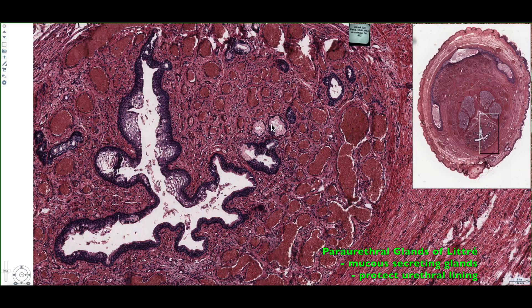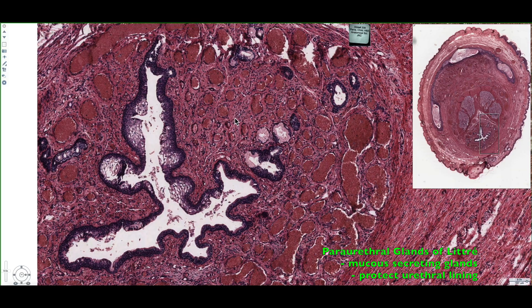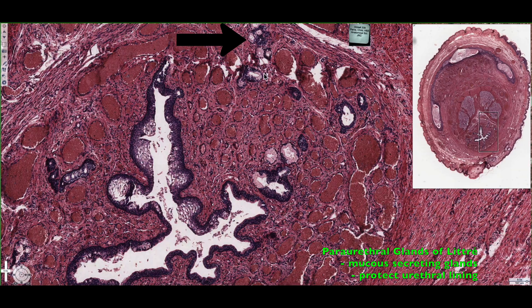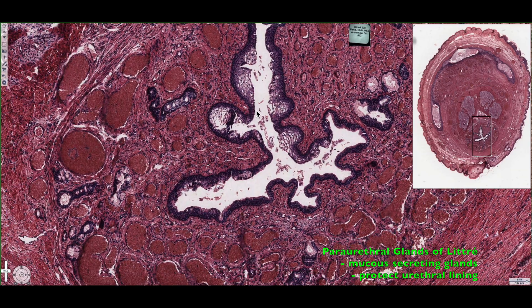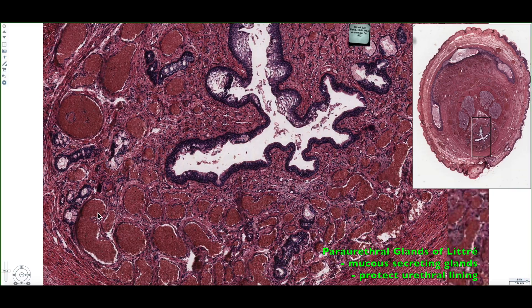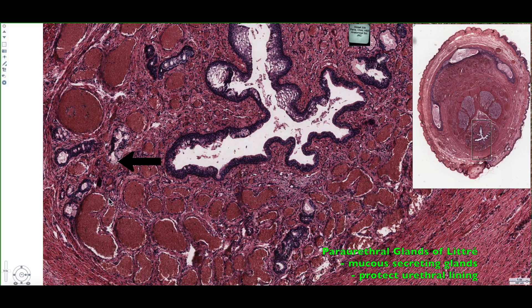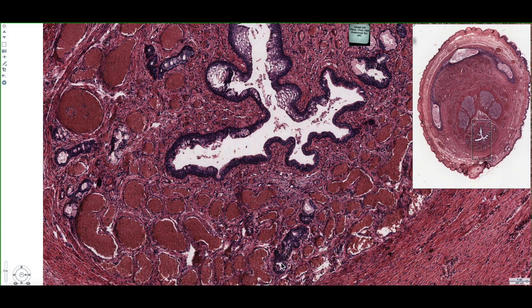These glands are not found on just one side of the section — we can actually see them all around: up here, on the left side, down here, and over this way as well. This whole region surrounding the penile urethra is filled with these paraurethral glands of Littré.